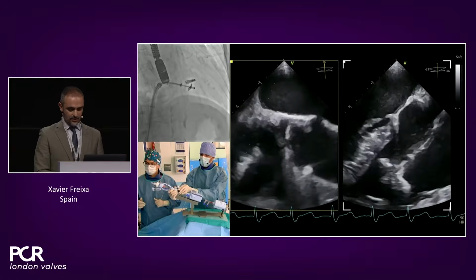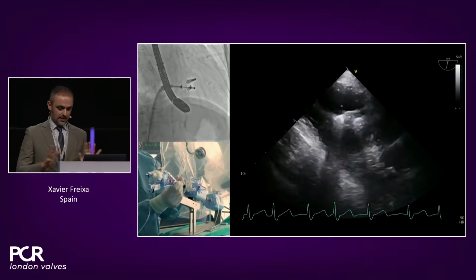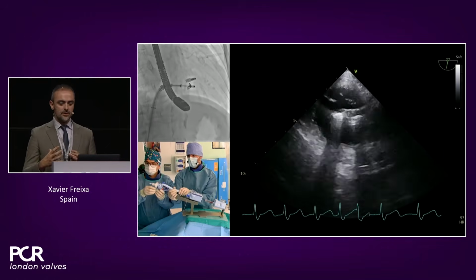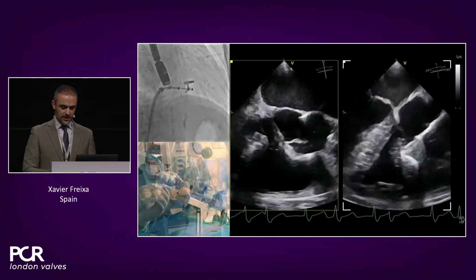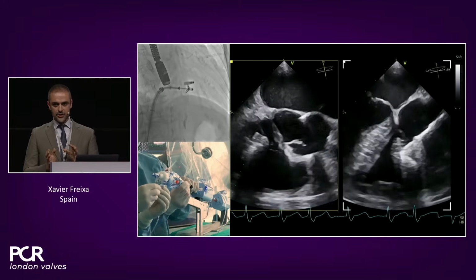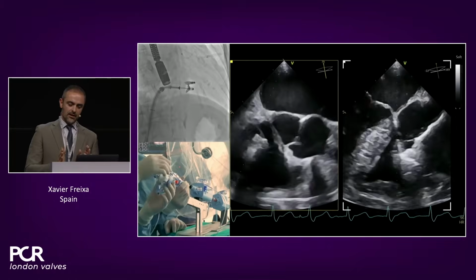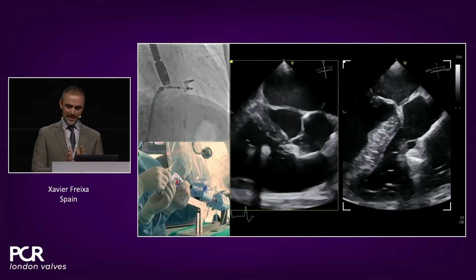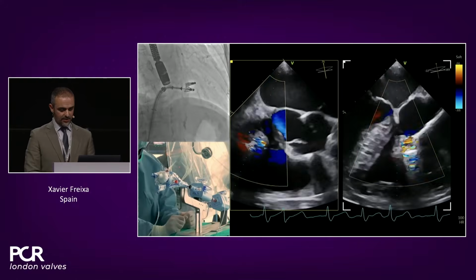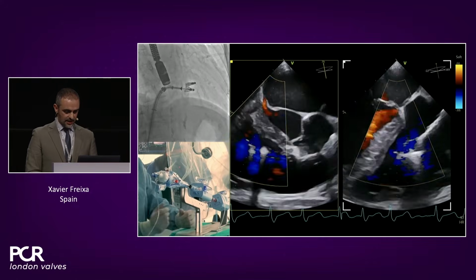So we want again into the ventricle, and we're gonna make some changes. So again, no rush, no problems. We don't like to turn too much, because we don't want to get into this cord. So we're gonna change a little bit the strategy. We're gonna counterclock a little bit the clip to try to get rid of the septal arm of the other clip, and in this case, we close.